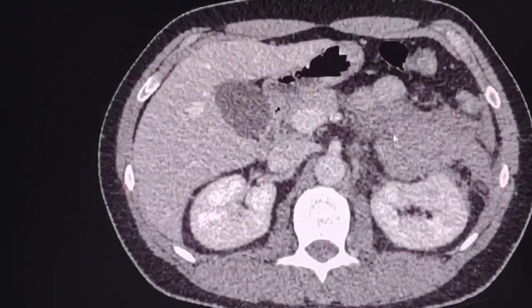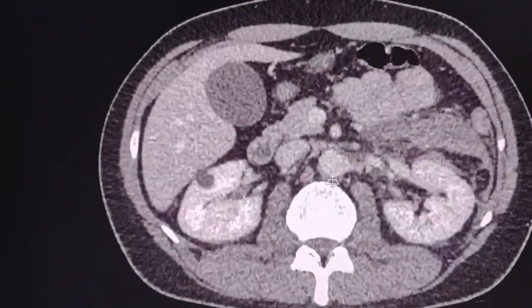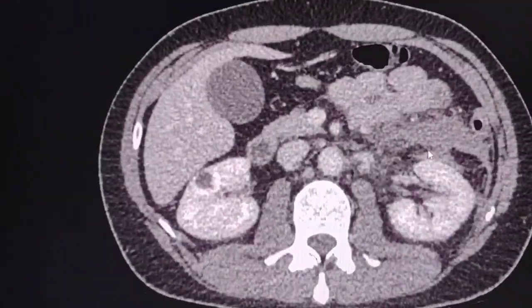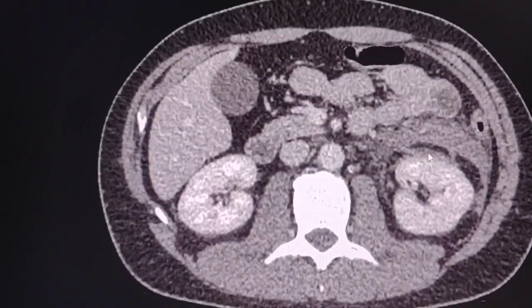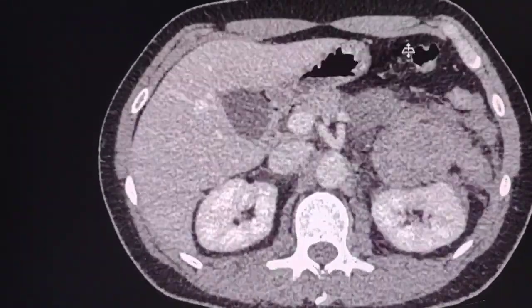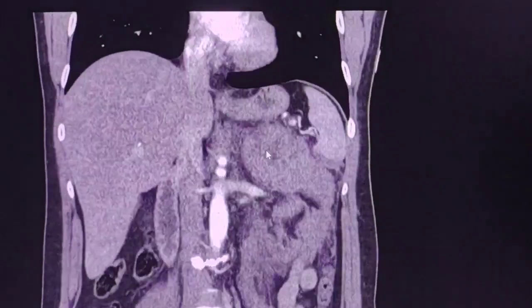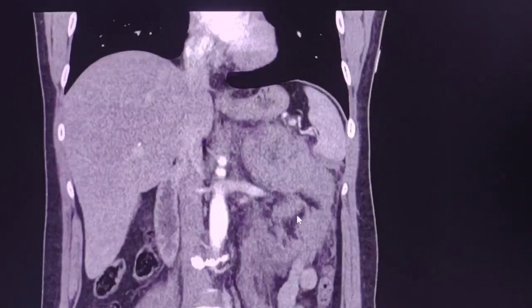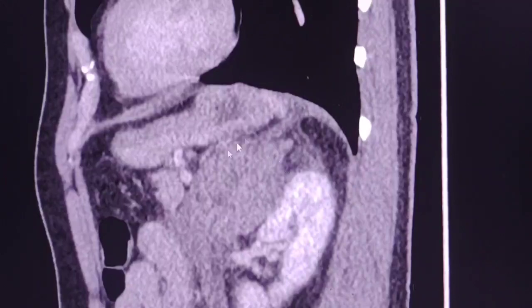We can see the retroperitoneal hemorrhage and the hematoma. There is also some perirenal reactive fluid, which is probably hemorrhage as well. In the coronal views, here is the lesion and here is the hematoma. In the sagittal view, we can also see the lesion.